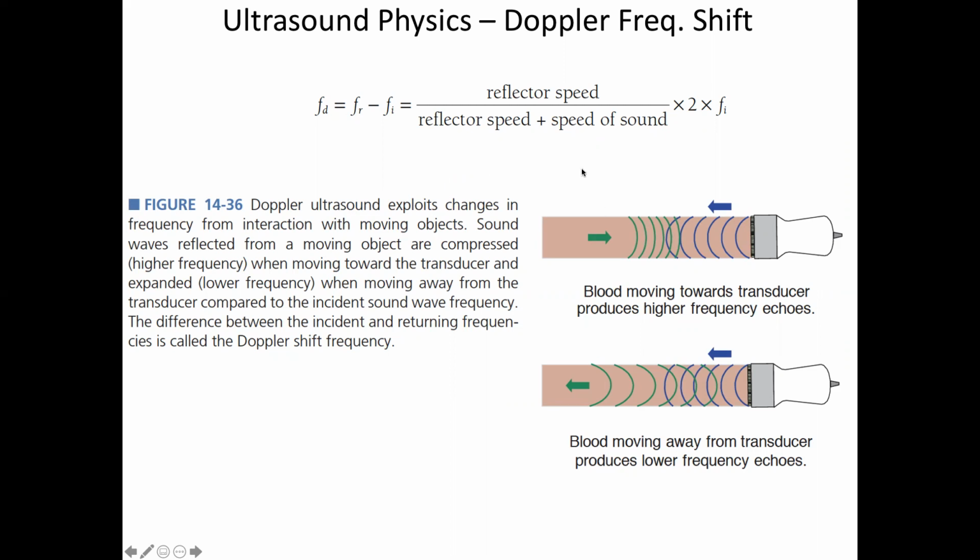And the Doppler effect is well known to all of us, right? An ambulance, as it's coming in, has a siren with a primary fundamental frequency. As it's coming towards you, the sound waves, or the peaks, are being compressed by the fact that it has velocity towards you. And so as you hear that sound wave, it sounds like a higher frequency. And then when it passes and goes by, the peaks in the sound wave get stretched because it has velocity going that way, and you hear the sound go down. That's classic Doppler.